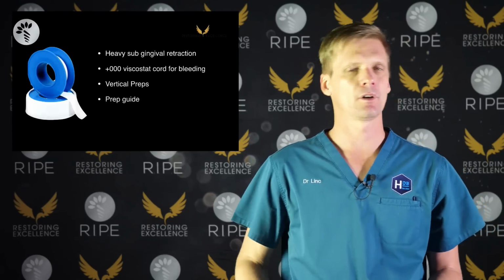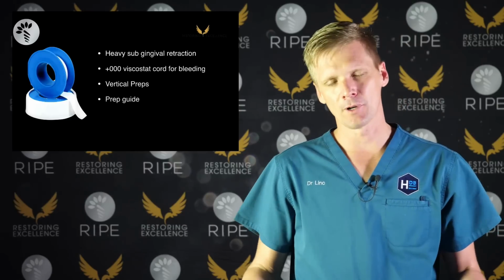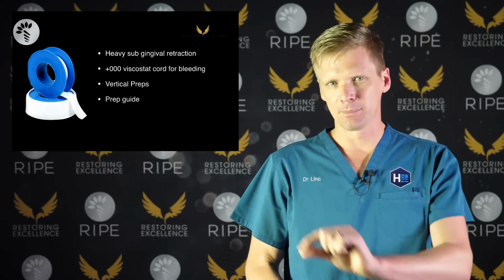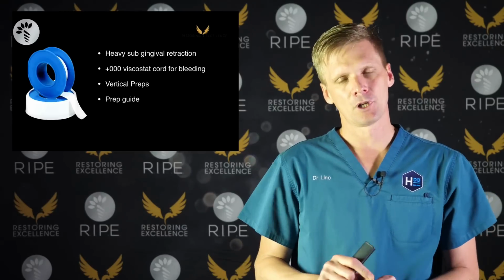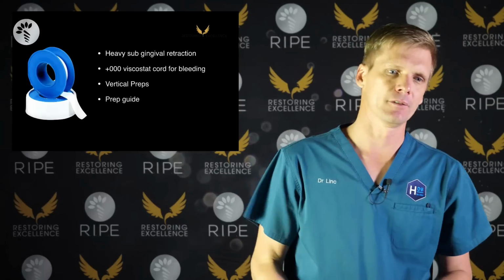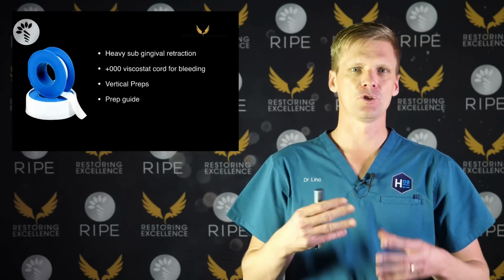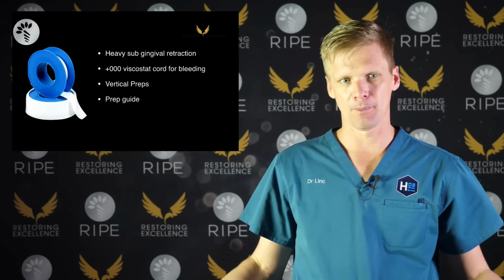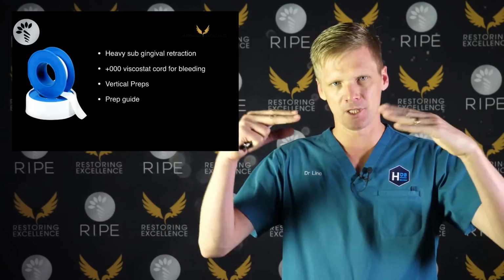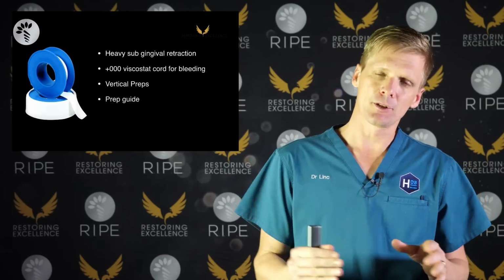So you use it where you're trying to expose quite deep margins, where you are doing vertical crown preps because they're subgingival anyway. If there's going to be a lot of bleeding, I'll place a 000 Viscostat-soaked cord first, and then put the Teflon over the top. I almost always use Teflon for vertical preps because you need massive retraction. There are even occasional times where I'll put a thick cord over the top just to stop the tissue falling over the top of the Teflon, and you can sometimes use it as a prep guide.